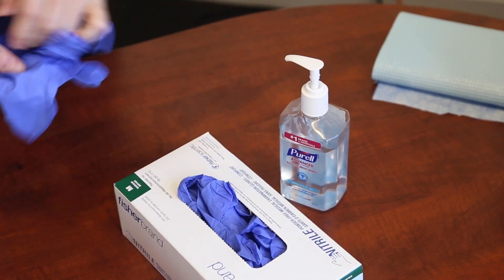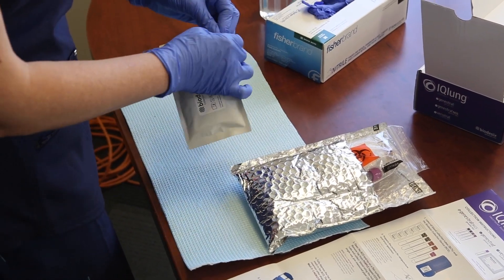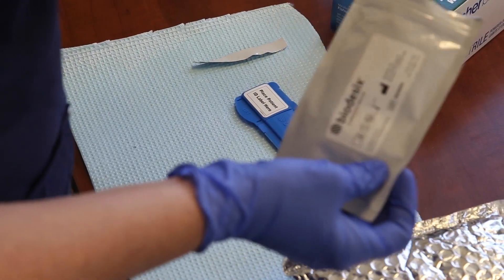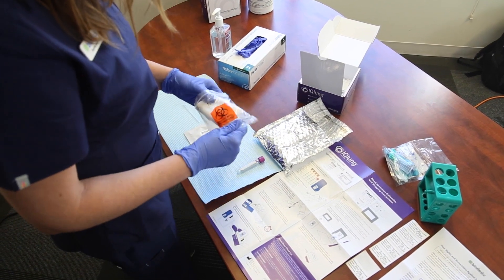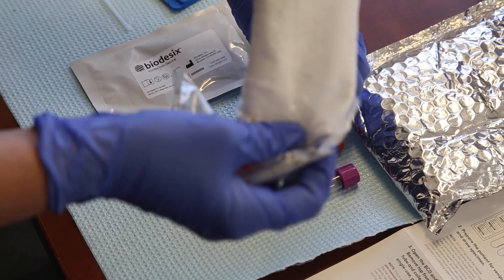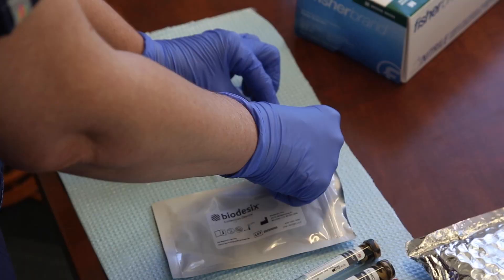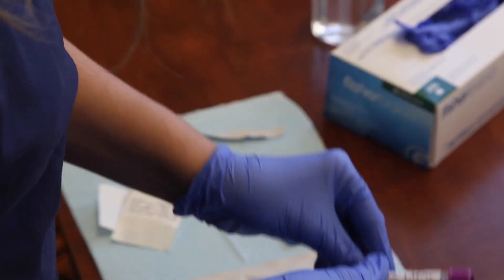Next, with proper PPE on, open the biodesics collection device pack containing one biodesics collection device and a pre-measured disposable pipette. Remove the purple topped tube, the two black and tan topped tubes, and the two brick red topped tubes from the biohazard bag. Label the biodesics collection device and all the blood collection tubes with the patient ID labels before the blood draw.